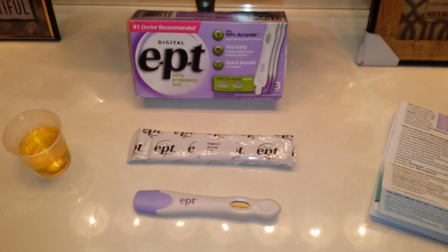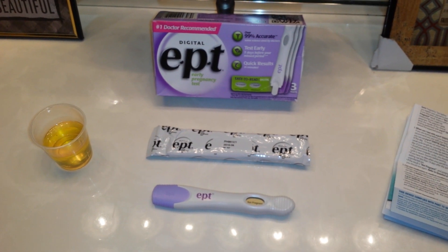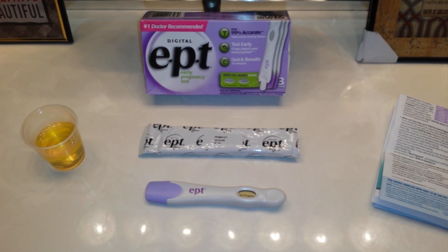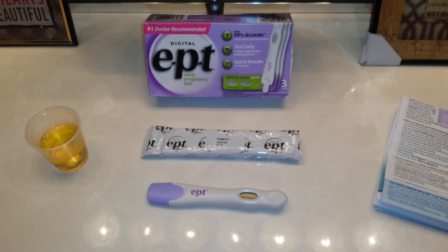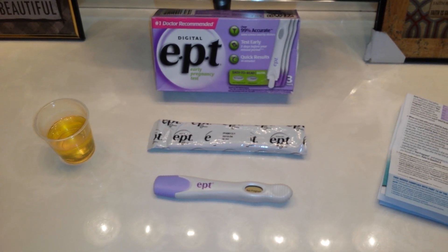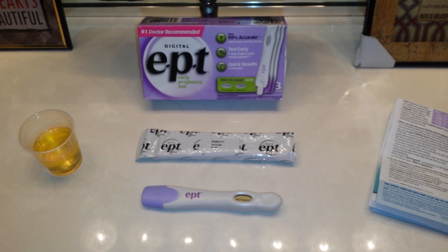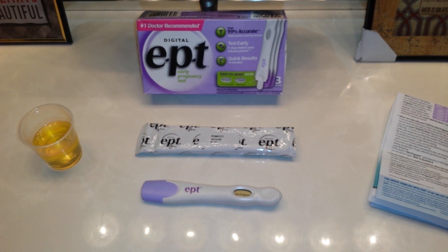I highly recommend staying away from blue dye tests altogether because they're notorious for false positives and dye runs. If you're not going to use digital, stick with pink dye. I believe the EPT digital test is 25 to 40 MIU, so these tests work best on the day of your missed period or after — they are not recommended for early testing. If you track ovulation and want to test early, use a more sensitive test in the 10 to 20 MIU range that can pick up lower concentrations of HCG.